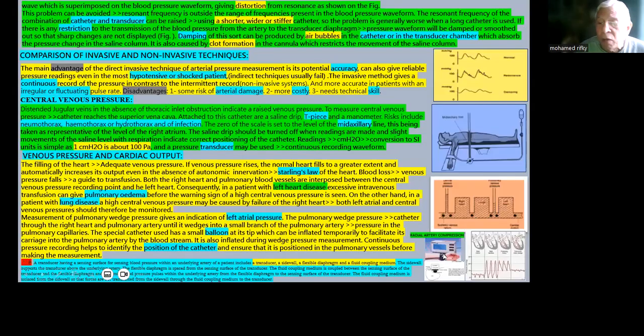Of course, there is an algorithm. This algorithm can measure, apart from the mean pressure, the systolic and the diastolic blood pressure. And the good thing about it is that it is capable of measuring the blood pressure after 12 to 15 beats. So this makes it reliable as a continuous-use device.